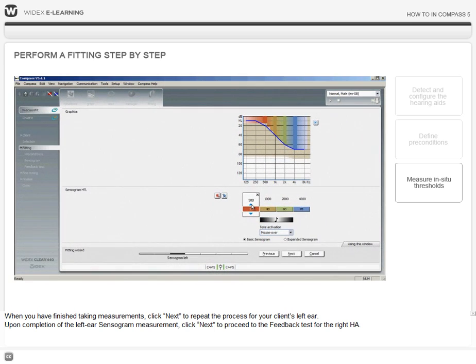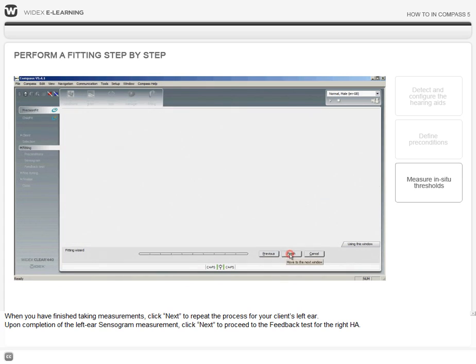Upon completion of the left ear sensorgram measurement, click Next to proceed to the feedback test for the right hearing aid.